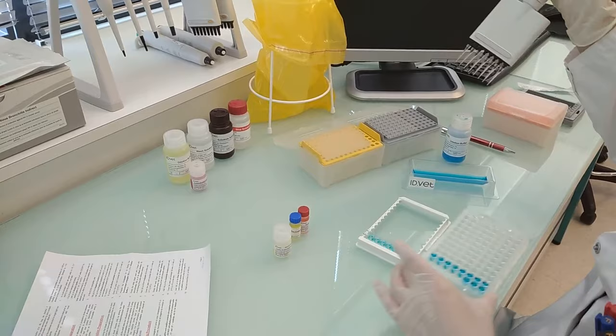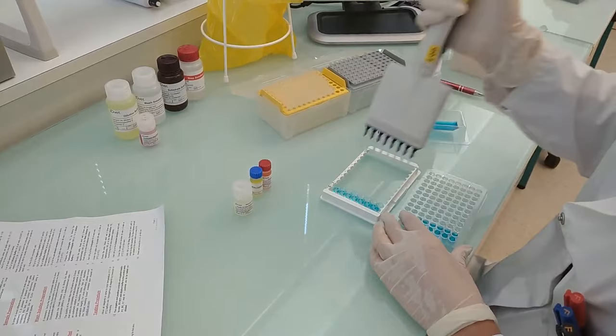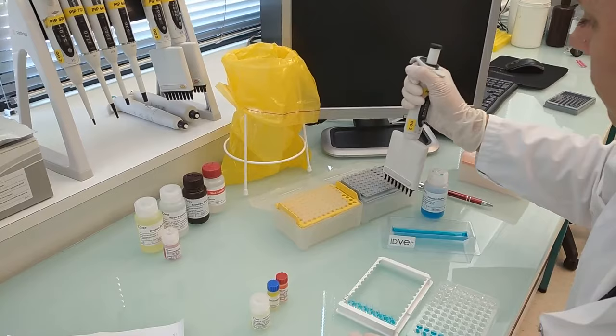Add X microliters of the prediluted samples depending on the final sample dilution. For example, for a 1 to 500 final dilution of samples, add 90 microliters of buffer and 10 microliters of prediluted samples.